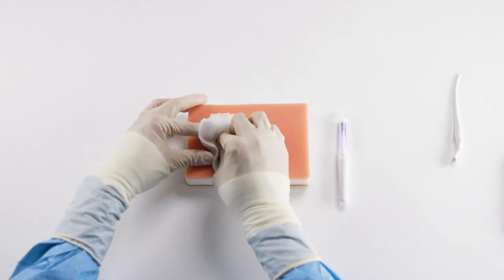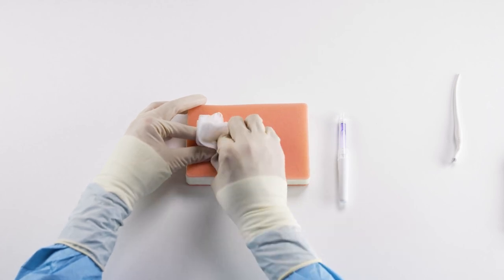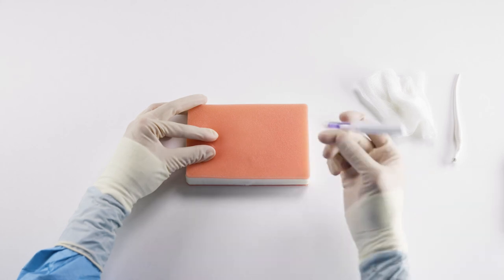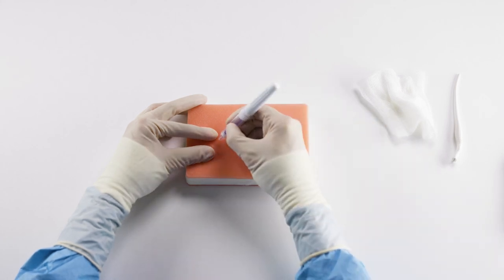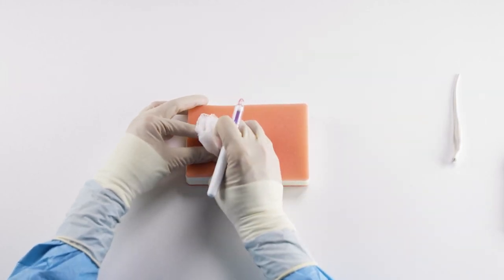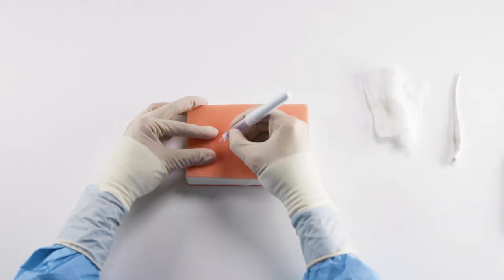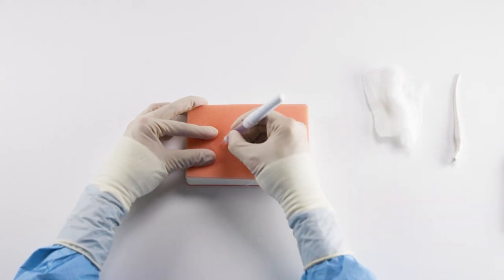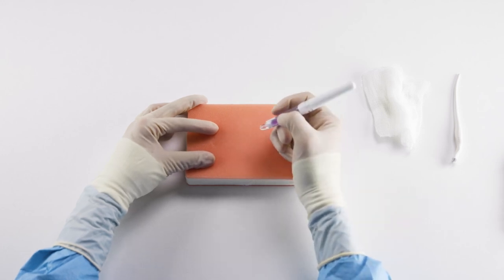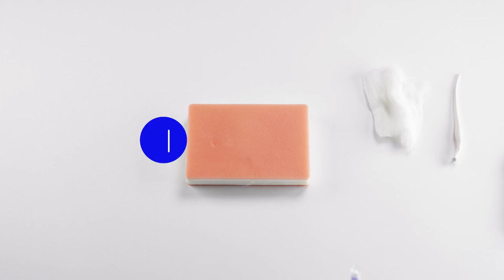You want to make sure the bleeding is completely controlled before applying Dermabond, which is my preferred closing technique. The bleeding appears controlled. I'm going to crack my Dermabond and put a few drops inside the incision. I'm going to pinch the skin to make sure that inner layer of the skin is approximated. Now I'm going to apply another layer of Dermabond above on the surface layer and allow that to dry over the next few minutes. And as you can see, we've completed the Medtronic RevealLink insertion and the patient is still smiling.